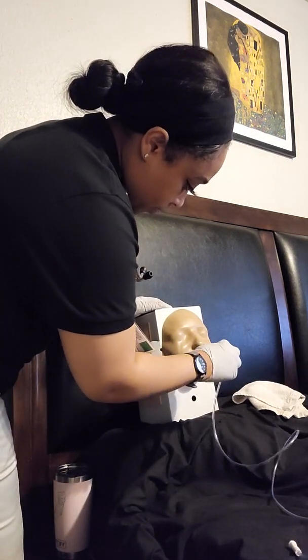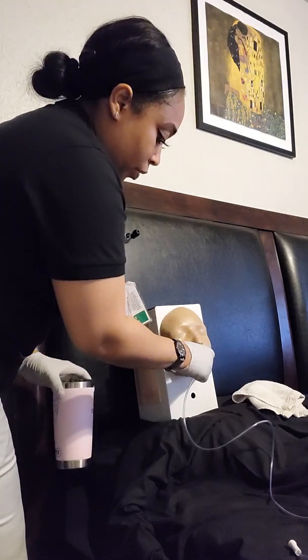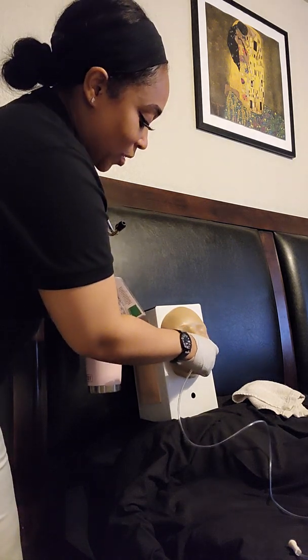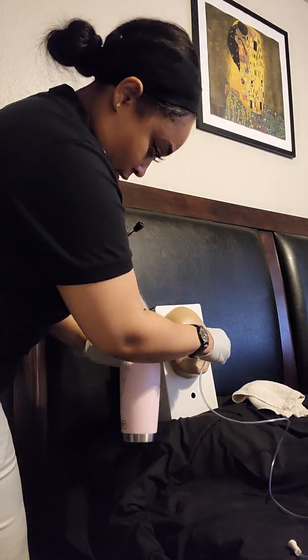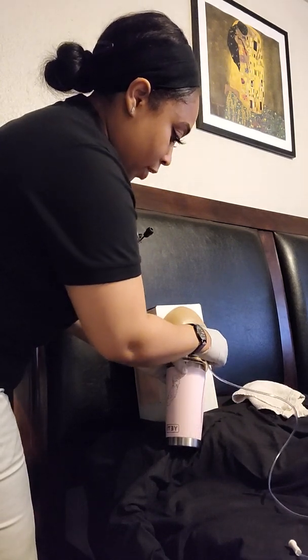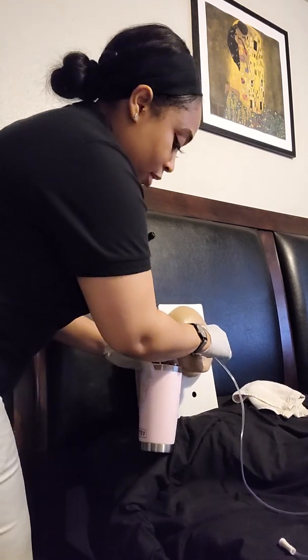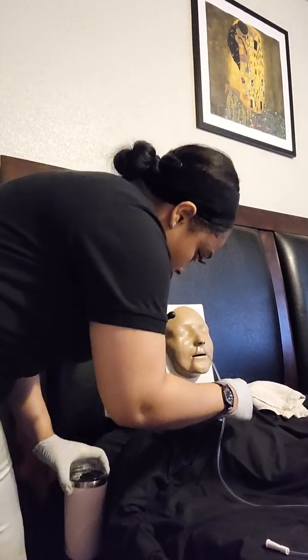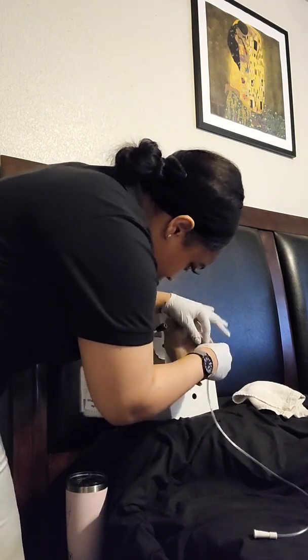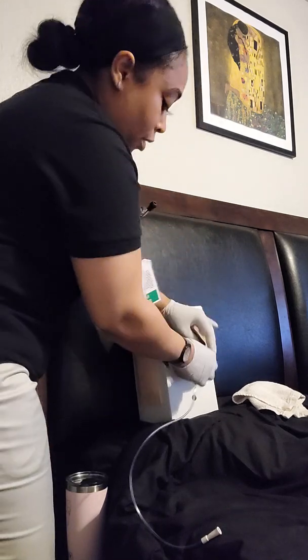I'm going to go at an angle and then go to the back of your throat. All right, you're doing good. I'm going to have you go ahead and lower your head. You are in a high Fowler's position at the moment. So I'm going to have you go ahead and lower your chin to your chest and go ahead and sip some water. Very good. You're doing great. Perfect. Keep on sipping. All right, you're almost there. Keep going. You're doing perfect. All right, we made it. We're at 63 centimeters. Great.